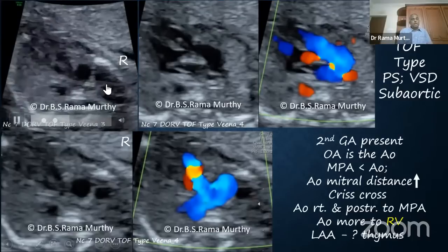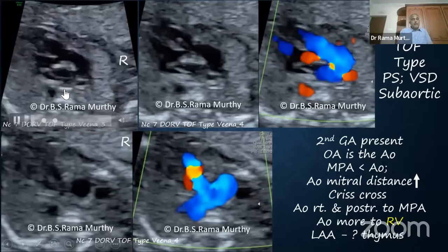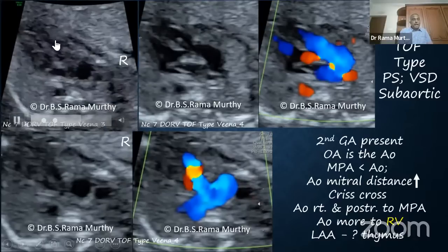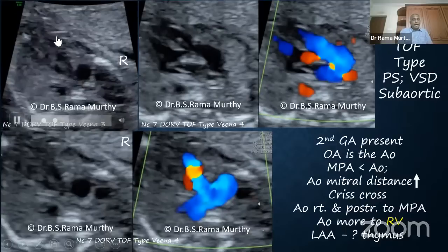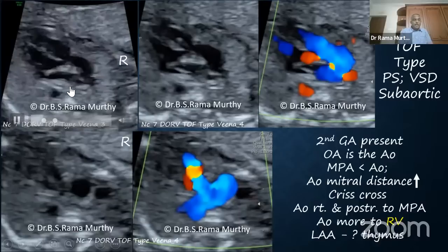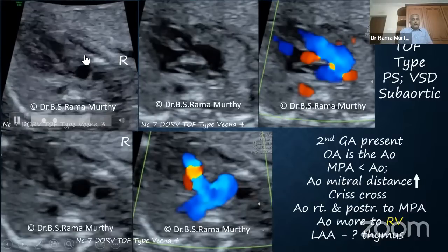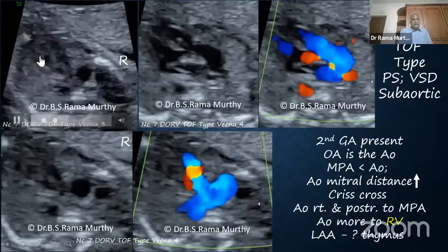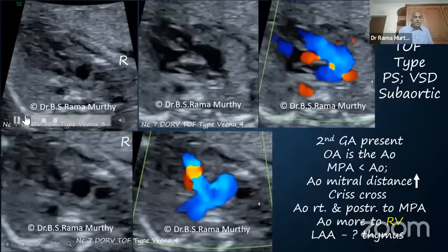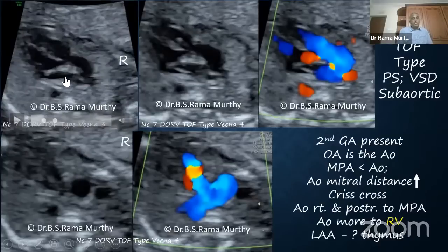The first thing I'm going to show you is an overriding aorta because it is arching. There is also a second artery which is coming from the anterior chamber. So this is the pulmonary artery because it's not arching. This is the arching aorta, right? Now, I just want you to realize the fact that the crossover is there. The ascending aorta this direction, pulmonary artery in this direction. But I will take you to one bookmark. That's the bookmark which I want you to see.